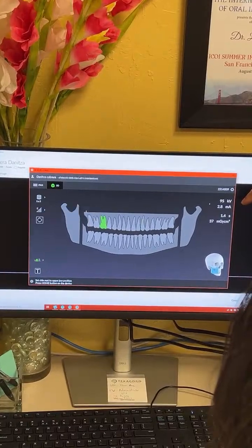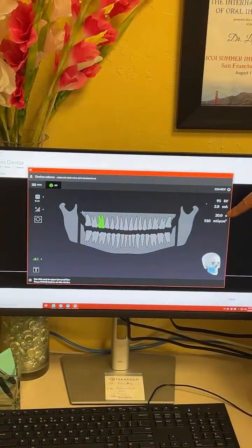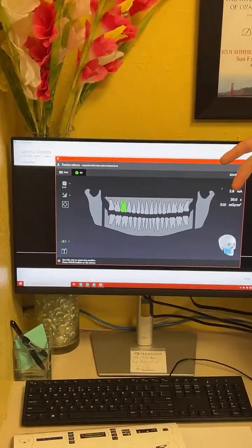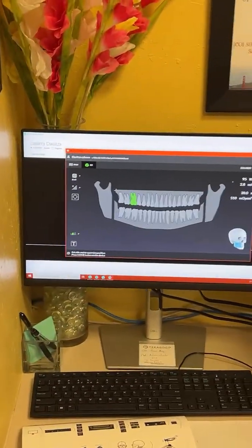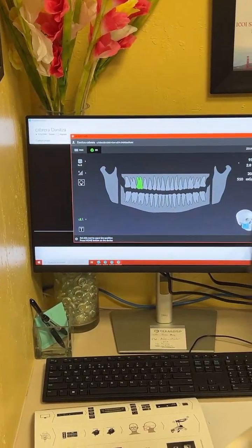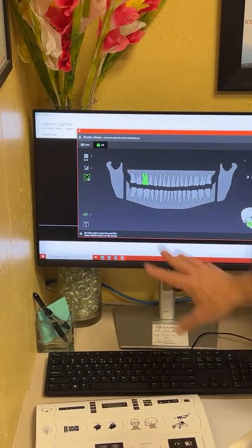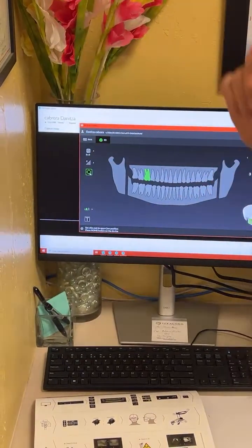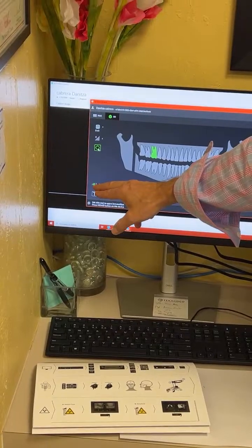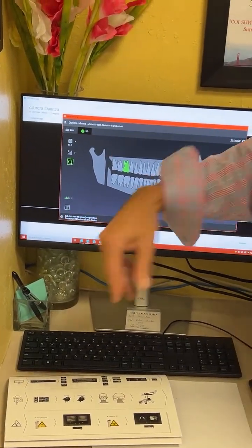So you're going for the best, Endo. But you really have to stay still, because you're in there longer. And that's where you do want to ratchet that head support. Now you can click this for the scout. You're fine. Now hit the home button on the device because it knows. Now here's your patient size. You already selected average. And now you need to hit the home button. So you're working in the maxilla.